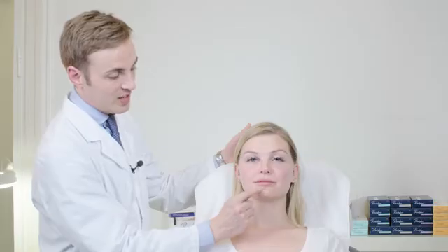For the lip, we used 1 ml of Restylane Kiss, and we split it: 0.4 ml into the upper right lip, 0.4 ml into the upper left lip, and then 0.1 ml as a bolus on each side of the lower lip.